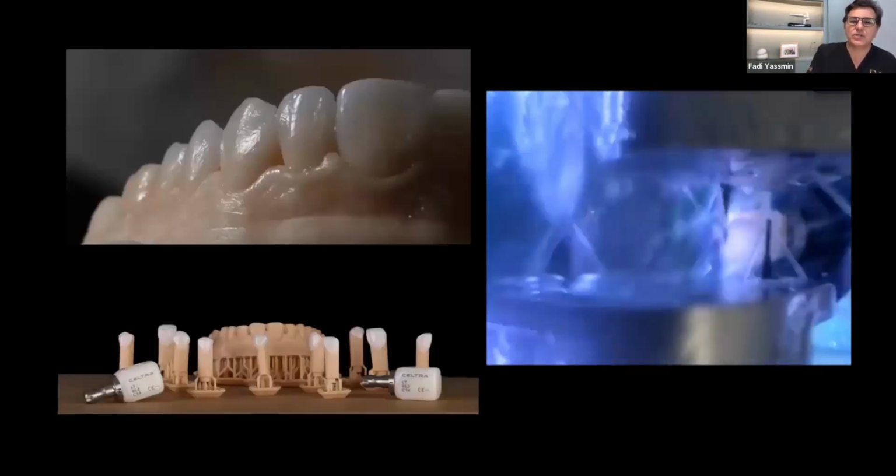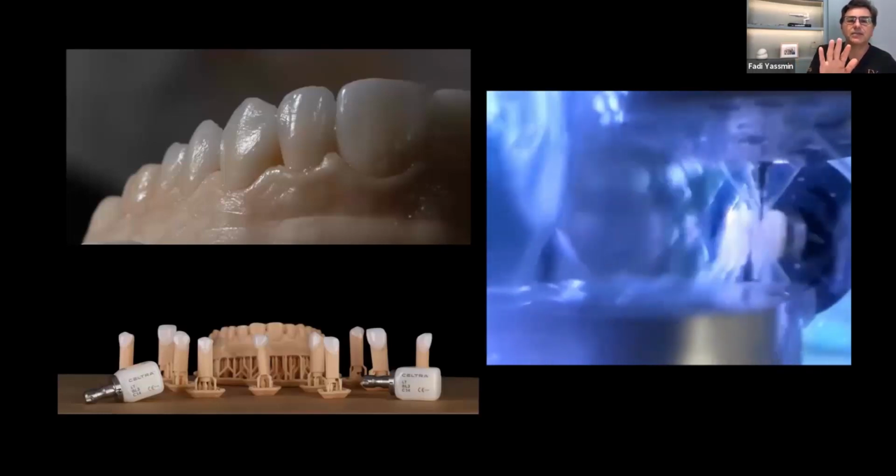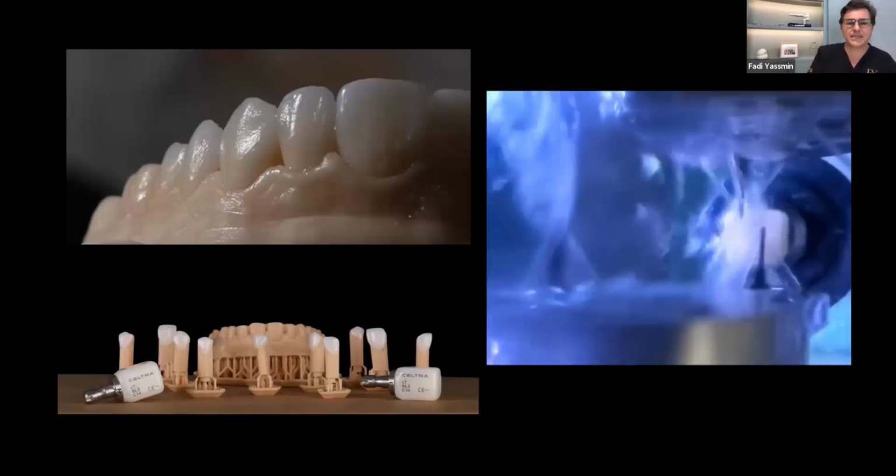So just getting back to some of these, each area has to be properly confirmed. We have the vestibular guides, we've got incisal reduction guides. All of these are so that the final design can be consistent, because a lot of these cases that we're doing now, you'd be very surprised, and we'll go into these, are milled block ceramics and then polished or lightly glazed and stained.